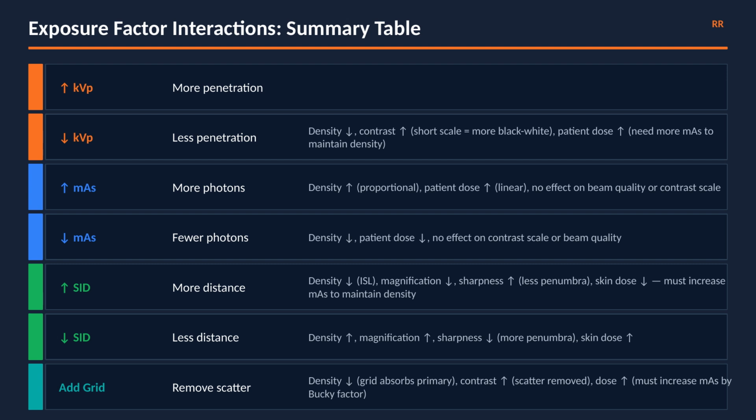No contrast effect. Increasing SID: density decreases by the inverse square law, magnification decreases, geometric sharpness improves, skin dose decreases. You must increase mAs to maintain density.